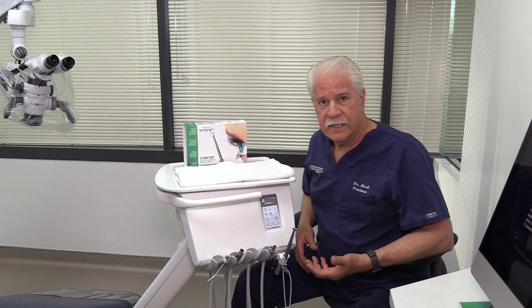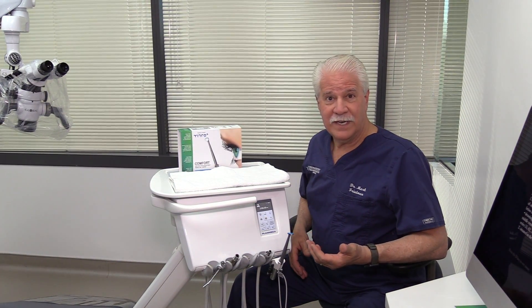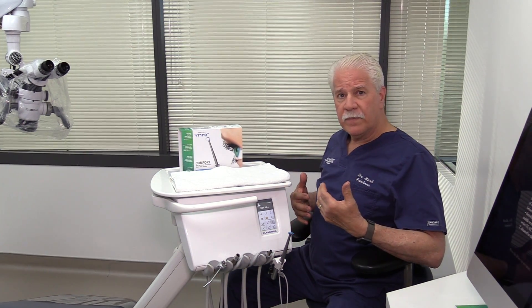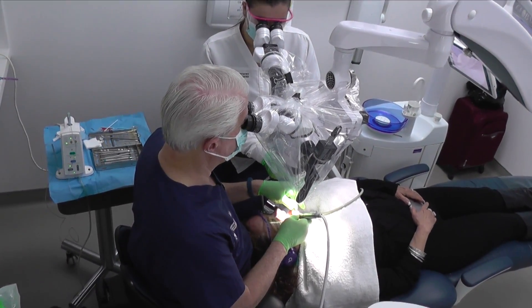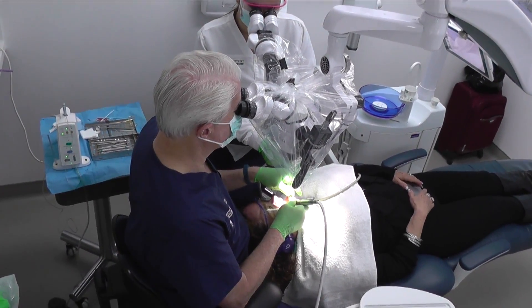In today's world of dentistry with high-level magnification, vision is the name of the game. And to have good ergonomics — to sit at the 12 o'clock position and really work efficiently, ergonomically, with head tilt between 12 and 20 degrees, everything in neutral — you really need to have good vision in your mirror.